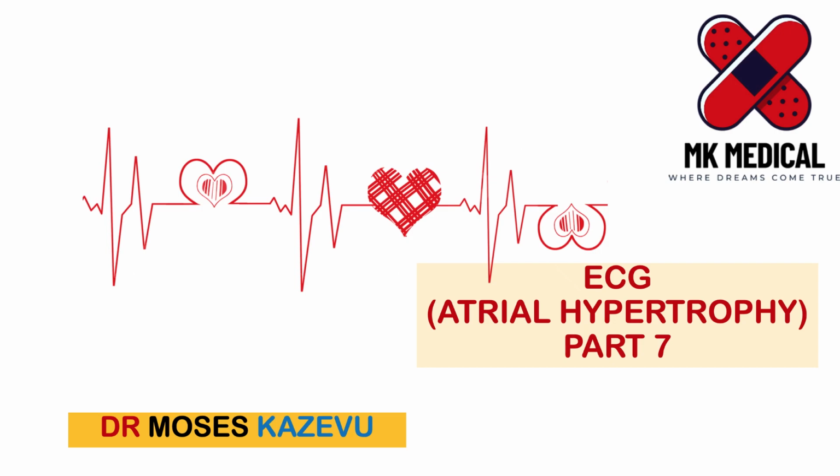I really hope you're enjoying these videos, and by the end of this playlist, you should be at least one step closer to understanding, or at least have a good understanding of, basic interpretation of the ECG. We have done the previous videos and I really hope you enjoyed them. So in this particular video, we're going to look at atrial hypertrophy. Grab a piece of paper and let's go.